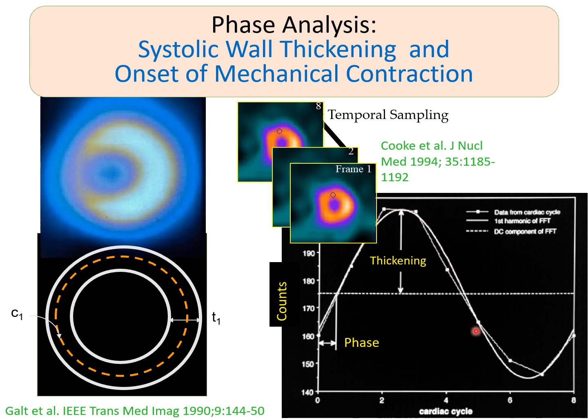As it gets thinner, it goes lower. So we're looking at a thickening curve, and we're replacing the 8 discrete counts with a continuous curve, which looks like a sine wave, which is what you get using this mathematical tool called a fast Fourier transform, or an FFT, in particular the first harmonic, which happens to be a sine wave.